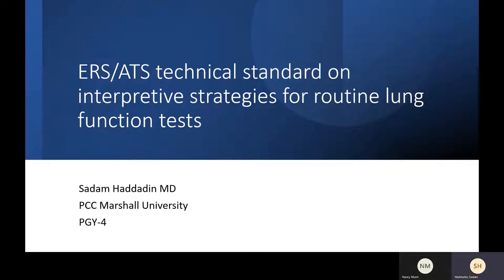This is a quick question for the GLI and NHANES. So the GLI, was it done for spirometry, lung volumes, and DLCO, or was it done just for spirometry? That's right. So when we go for the data, you can go with spirometry and DLCO done in the GLI, but the lung volume was only NHANES. Right. So if we change our software, it will say spirometry and DLCO with GLI and lung volumes with NHANES. Yep. But they are trying to put the lung volume in as well now. But it's right, I will talk about that.